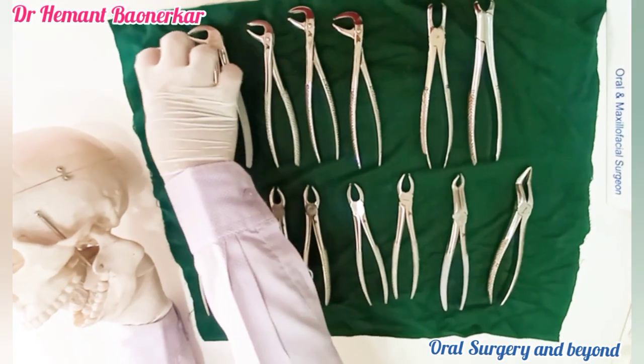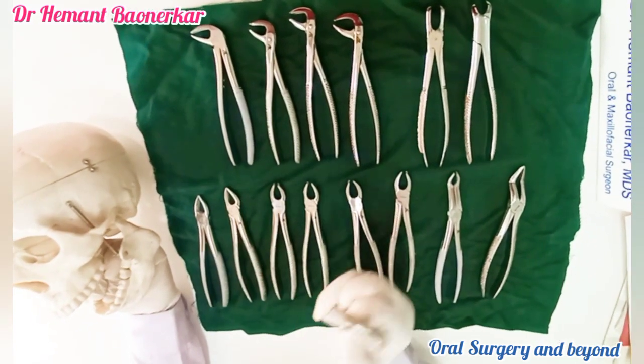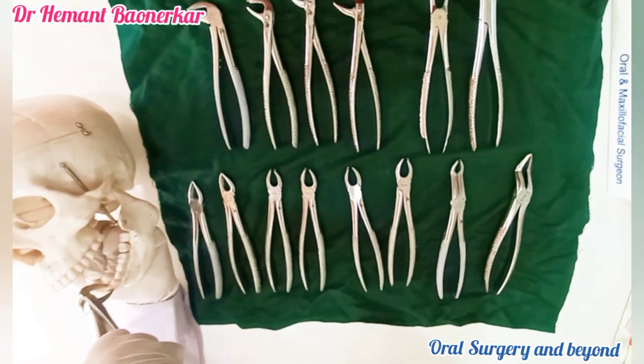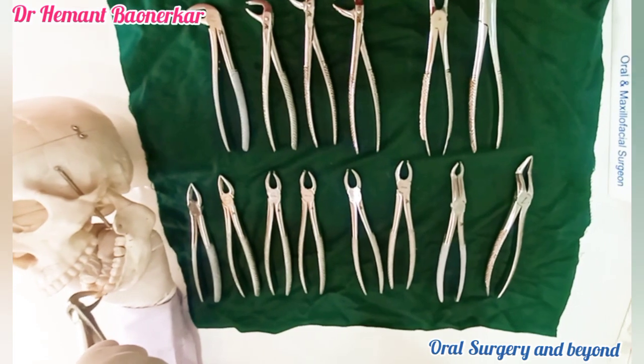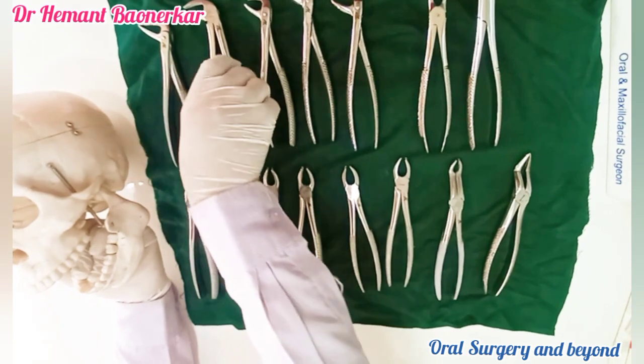Let us start with the mandibular forceps. As I said, mandibular forceps always have a 90-degree angulation. This is the mandibular anterior forceps. We can hold this forceps like this, rotate the tooth, and take it out. This is a single instrument.